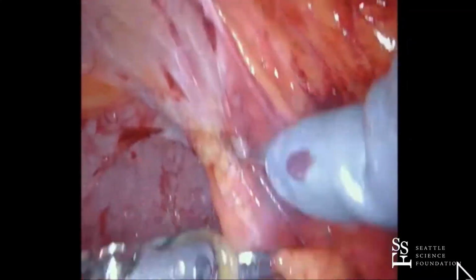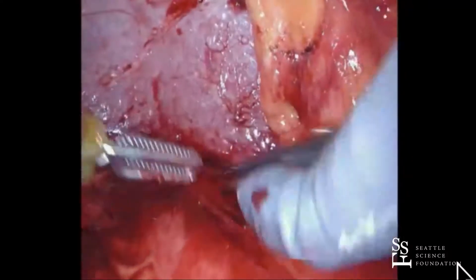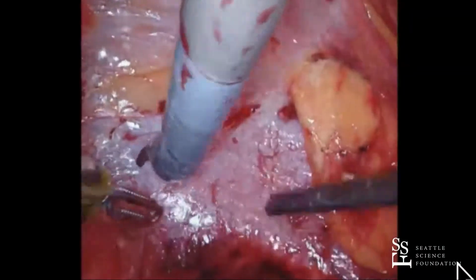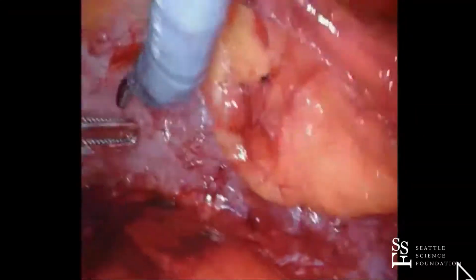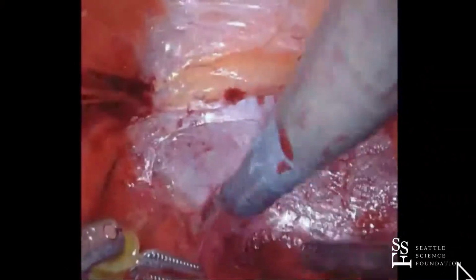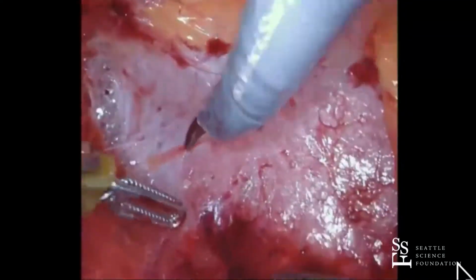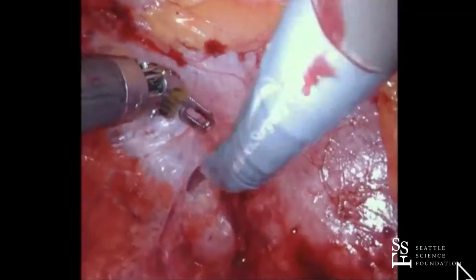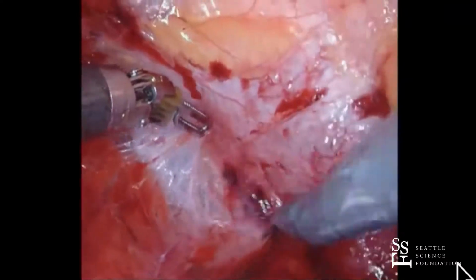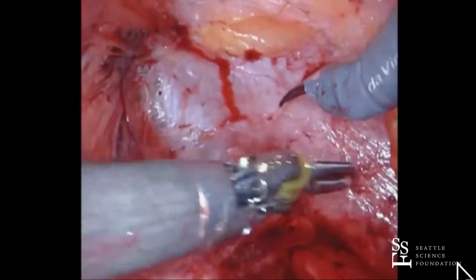So everyone's kind of oriented, right? Gerota's is underneath. So here's psoas. The patient's head is here. The patient's foot is here. One of the places I start is right here on the posterior body wall. I'm not going to get in Gerota's. I'm just going to push it off the sidewall. Because this case, if you think about it, you start with a very small space, and all you do during the case is make it bigger and bigger the whole time. So I go away from the scope the entire time.